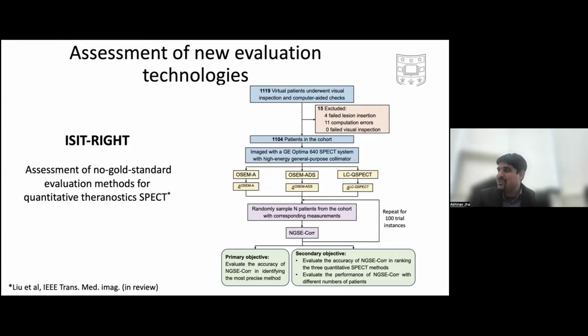So to ask that question, we need to have a sample size, but ranking is a nonlinear function of the data itself, because with ranking, you get a number, but then that maps nonlinearly to rank number 1. Someone gets a 90, another one gets a 10, that's rank 1, rank 2. And someone gets a 90 and another one gets a 50, and that is also rank 1 and rank 2. So we had to do a lot of power analysis to be able to identify the right number of patients. It was very complicated, very tricky. The statistician even had to learn stuff probably to do this, right?